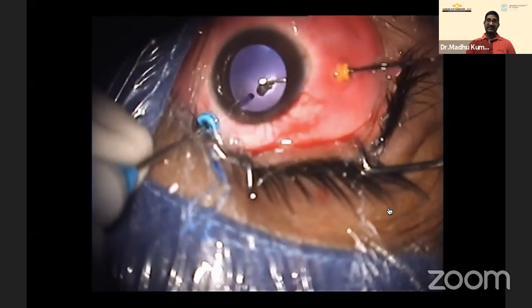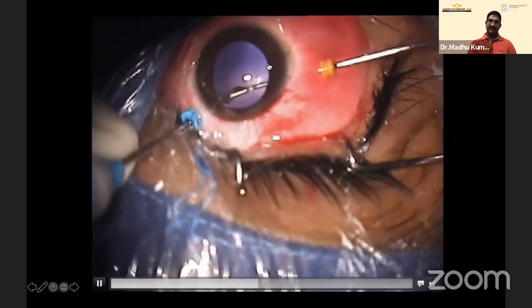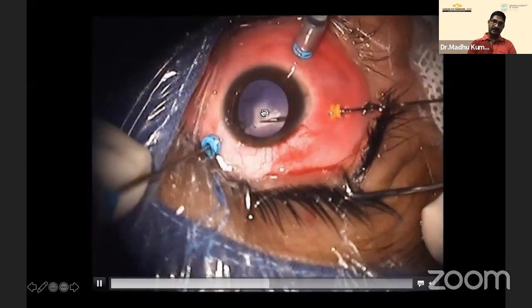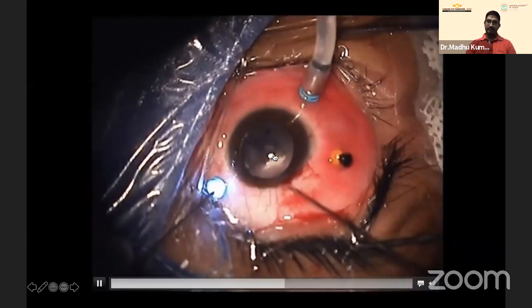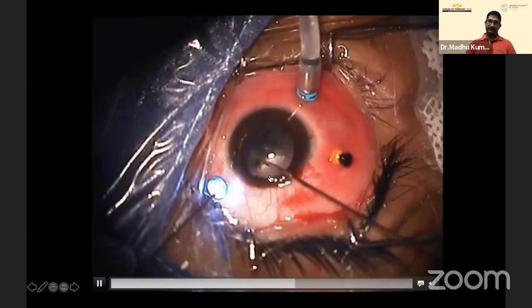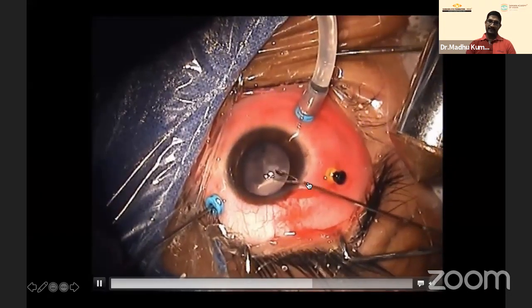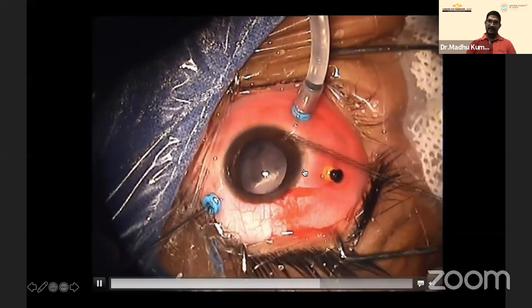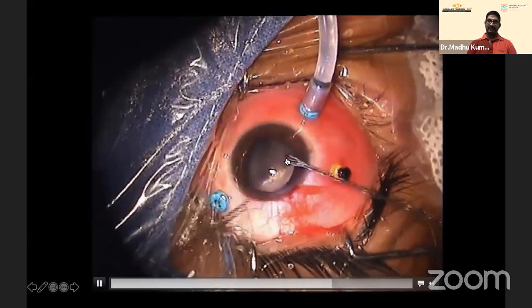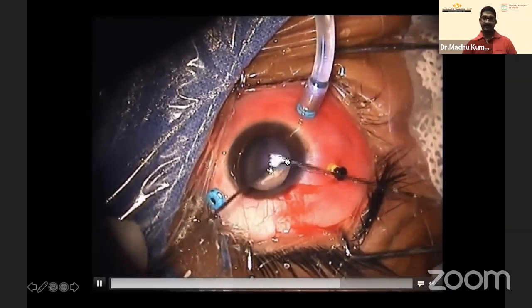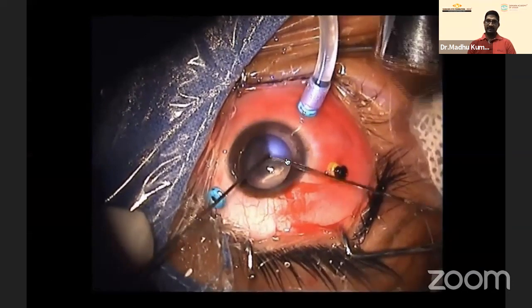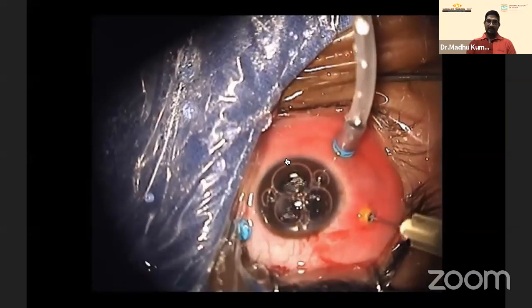Using 23- and 25-gauge ports, the forceps was temporarily magnetized, and the foreign body stuck to it without being physically held. Because a cataract was already present with intact anterior capsule, a small central opening was made and the foreign body placed on the capsule. Then through a clear corneal opening, using the same magnetized forceps, the foreign body was removed. Intravitreal antibiotics were injected due to some exudates — a truly sutureless intervention.